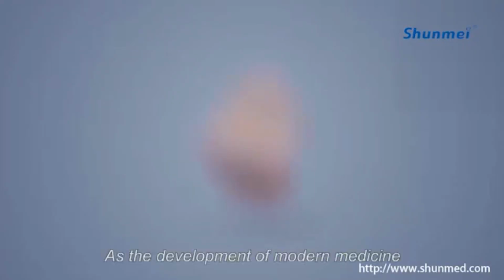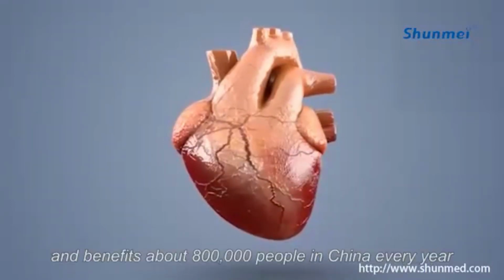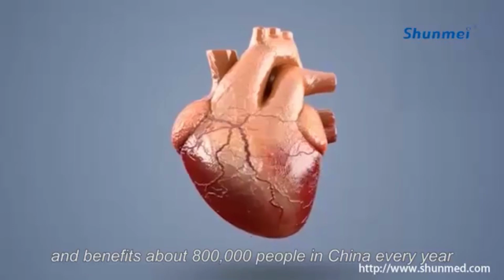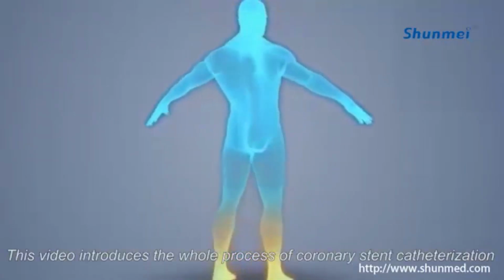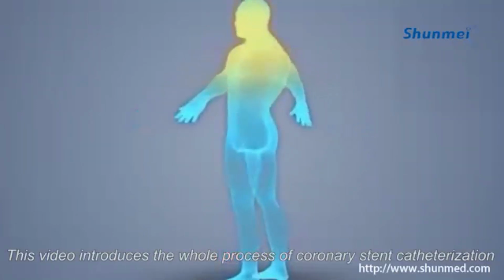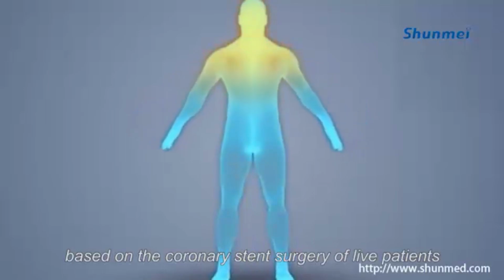With the development of modern medicine, the coronary stent is understood by more and more people, and it benefits about 800,000 people in China every year. This video introduces the whole process of coronary stent catheterization based on the coronary stent surgery of live patients.